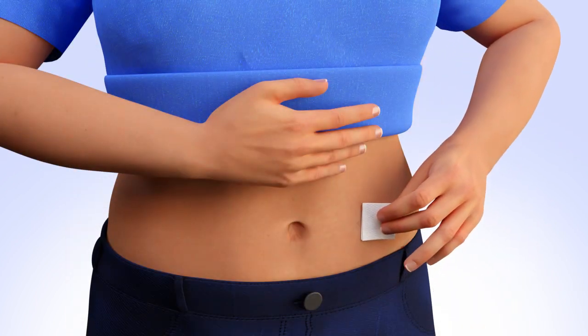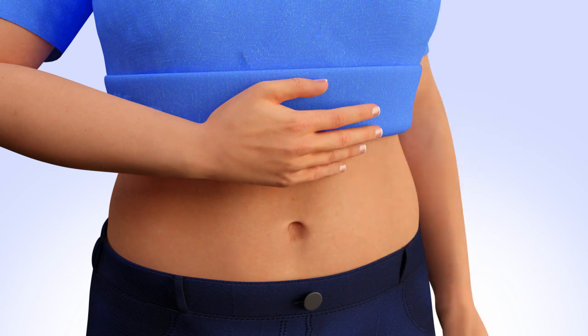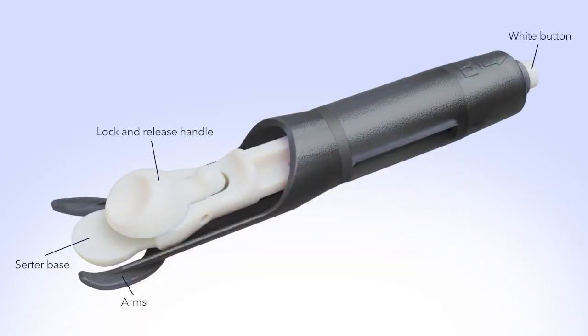Rotating your site is key to keeping your infusion sites healthy. Clean your infusion site properly with an alcohol wipe or prep wipe. Allow your site to air dry. Pick up the MiniMed SilSurter.